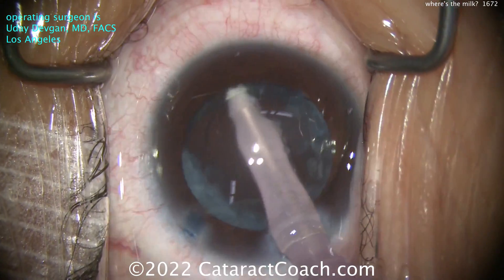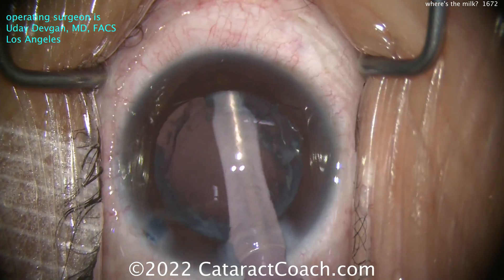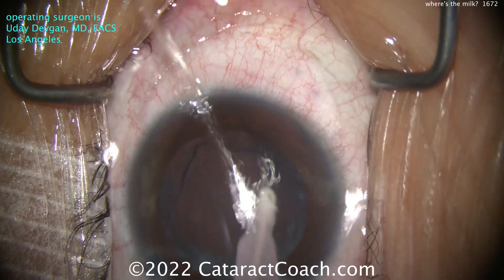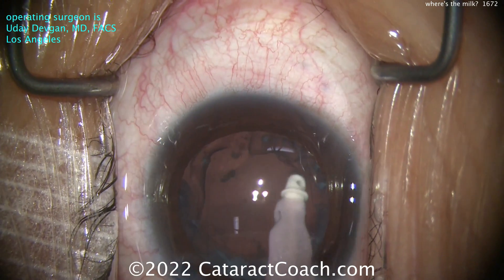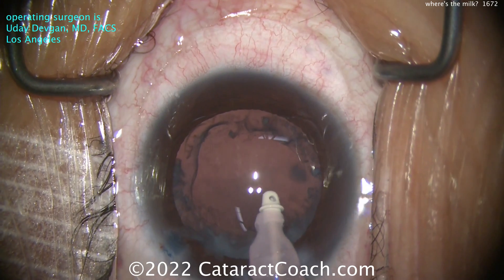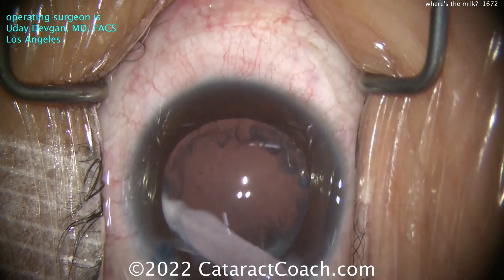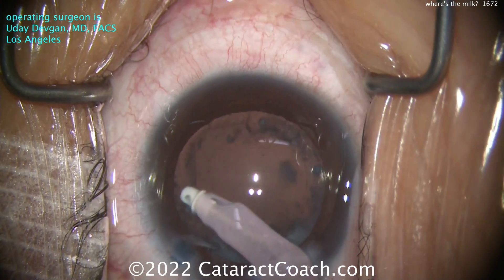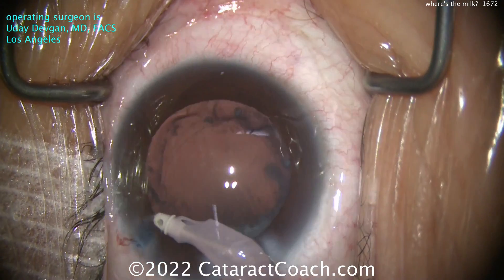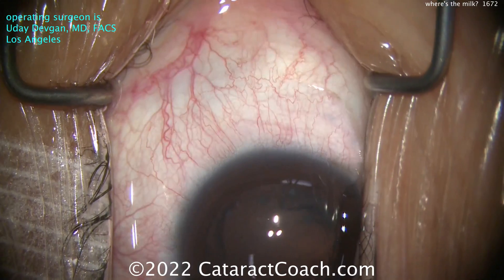There are pictures, an article, text, diagrams - a whole lot of good stuff to show you the spectrum of white cataracts. You need to be an expert, especially if you're in a hospital where you're training and there are a lot of white cataracts. Cleaning up here, you can see there's a lot of adherent material and scarring on the lens capsule bag. You're not going to be able to get all of this out - you don't want to damage the capsular support or any zonular support.